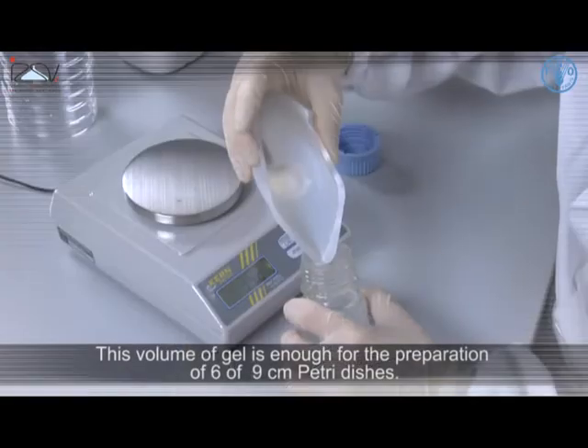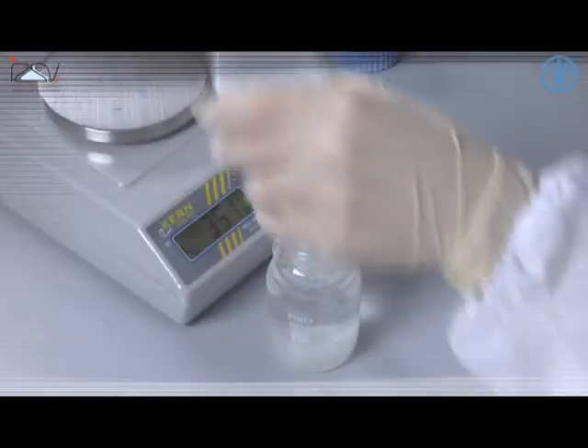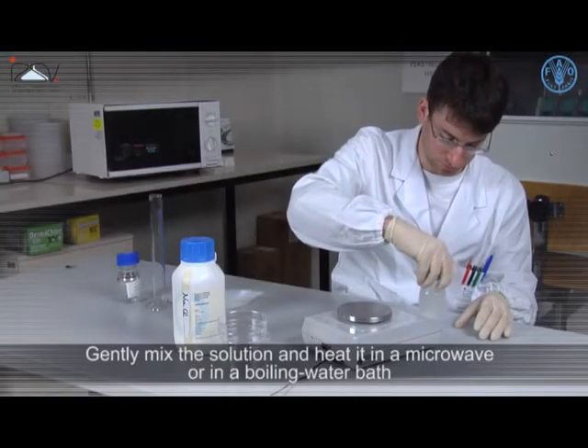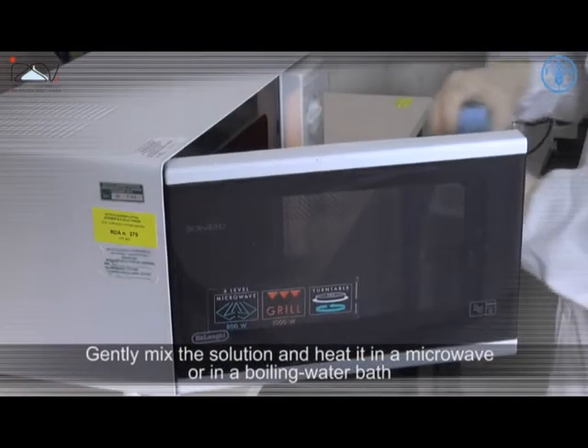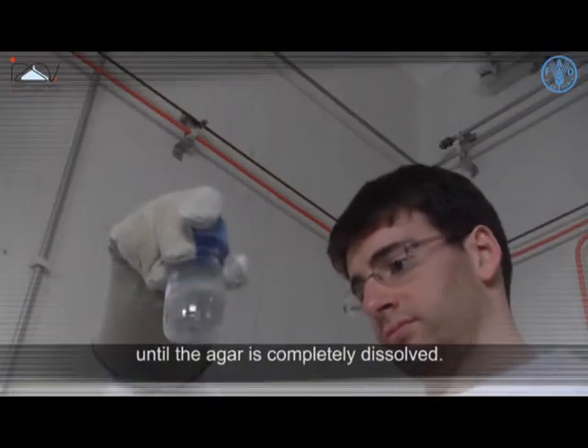This volume of gel is enough for the preparation of 6–9cm Petri dishes. Gently mix the solution and heat it in a microwave or in a boiling water bath until the Agar is completely dissolved.